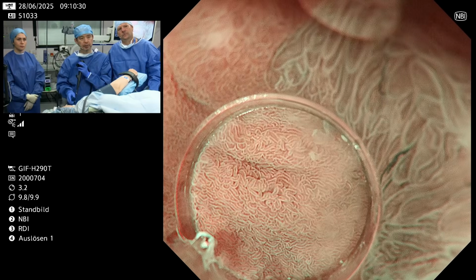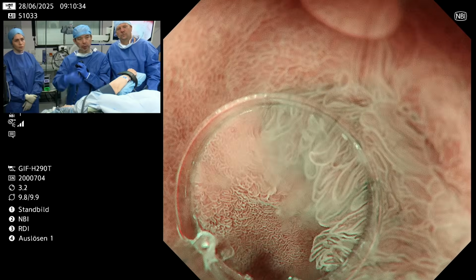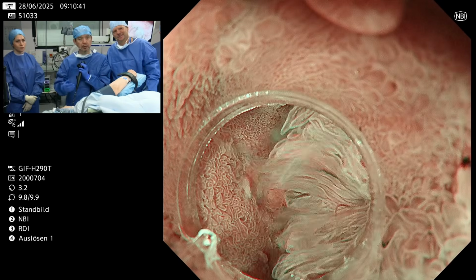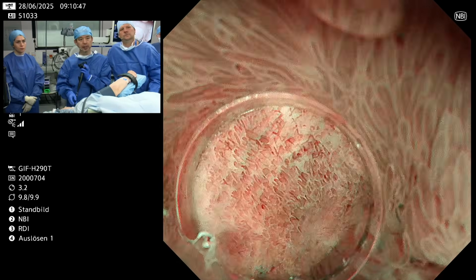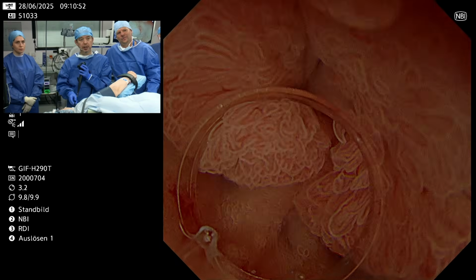I prefer to do my procedure in an underwater condition because we can float up the entire target lesion throughout the procedure. And of course, active normal saline irrigation makes it much easier to go into the submucosal space. Okay, let's start the procedure.